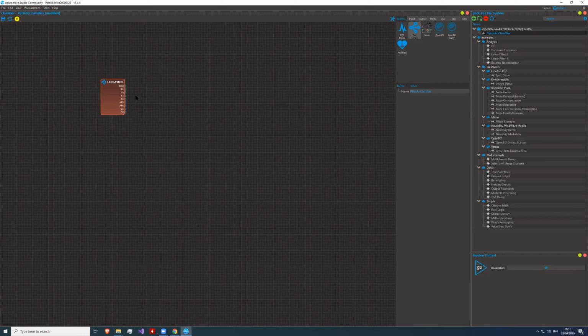Yeah, absolutely. For instance, speaking about the Emotiv, it's literally the only step required for the community to get Emotiv support into the Neuromore Studio: use our source code. You download the library from their website, place it in a folder, press build, and you're all set. That's the only missing piece, and it's restricted by some of the manufacturers, so we are not allowed to pre-build it and ship their libraries together with the Studio.